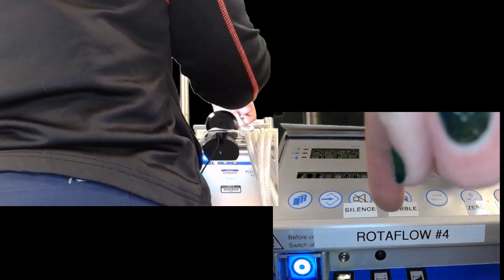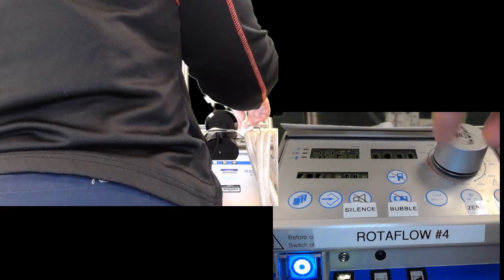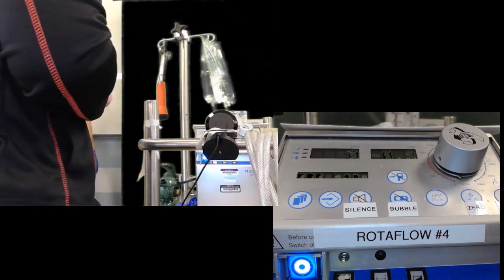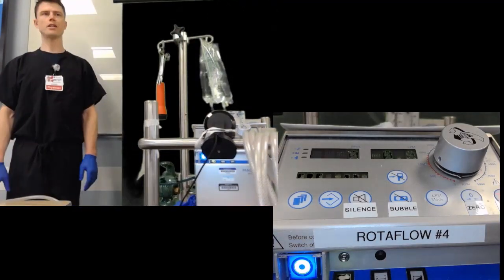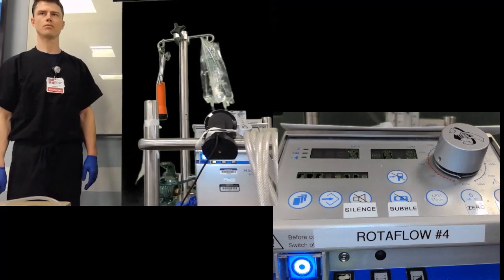So am I turning the actual one? You turn it down to 0. See how it just spins? So how do you make it actually turn down? Push it. Exactly, you push it in, and you'll see the RPMs go to 0. Cool. So when you're ready to come back on, we'll unclamp and go back up on our flows.